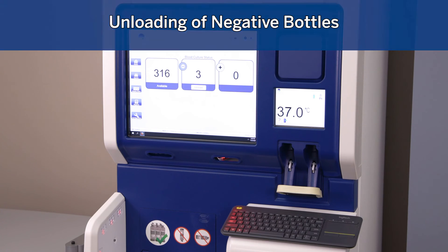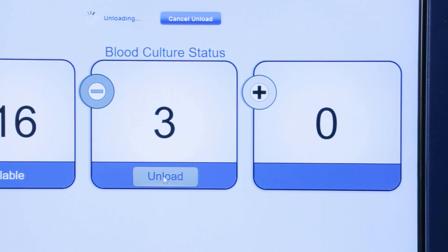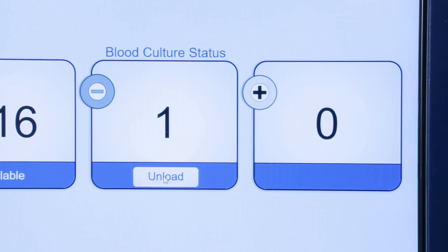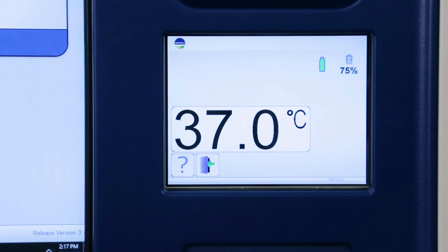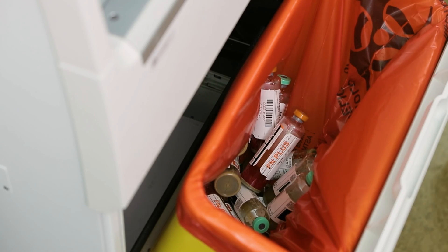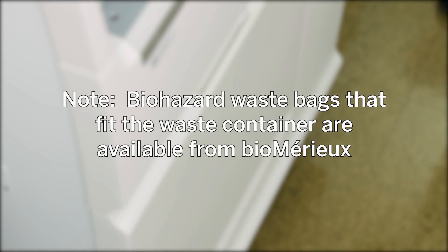Unloading of negative bottles: bottles which remain negative when they reach their maximum test time are considered final negative. These bottles are unloaded by the robot to the waste container. Negative bottles can be configured to unload automatically, or configured to be manually unloaded, which would require the user to press unload on the large display screen before the robot will drop them in the waste container. The waste container on each instrument can hold approximately 50 bottles. Indicators on the small display screen will provide visibility to the current fill level of the waste container. The robot will stop unloading negative bottles if the waste is full, the door is open, or the bin is missing. Biohazard waste bags that fit the waste container are available from BioMerieux.